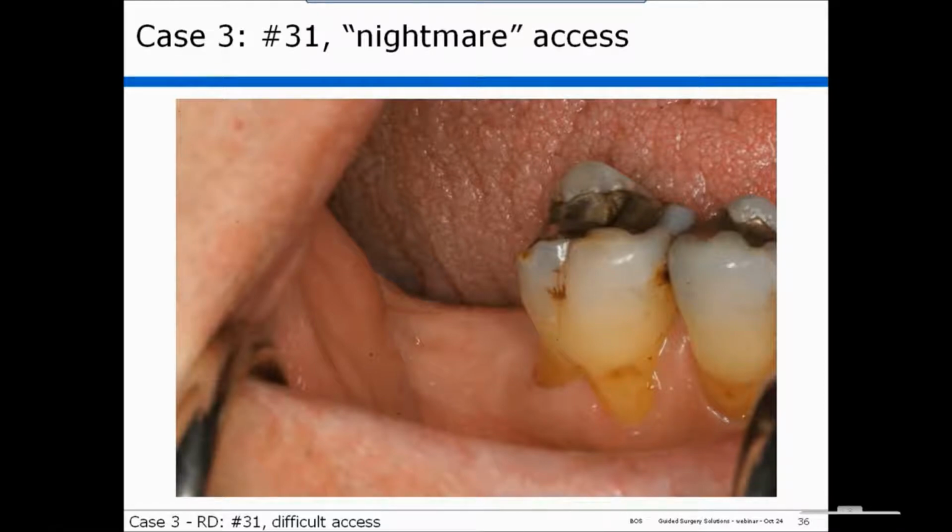Okay, the next question that came in is asking if the drill guide also acts as a stop for the depth. Yes, that's exactly what it's designed to do.